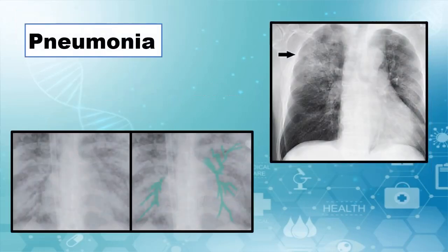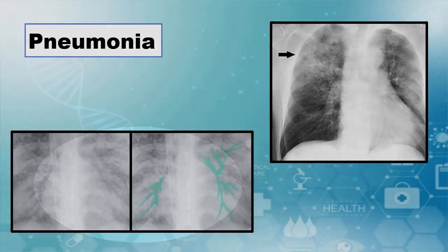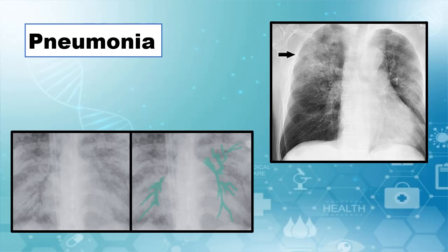In pneumonia we will find consolidation and air bronchogram. The presence of an air bronchogram indicates that the density is in the alveoli and not the large airways. A good tip for discerning between pneumonia and a solid mass is that vessels passing through a mass get distorted, in opposition to pneumonia consolidations, where vessels run through the consolidation intact.